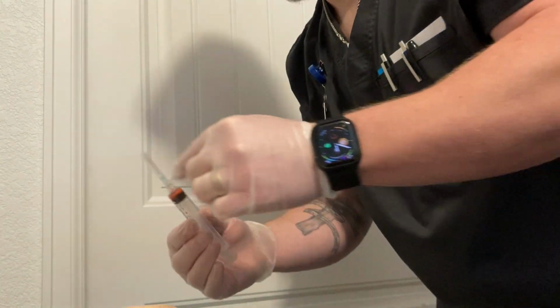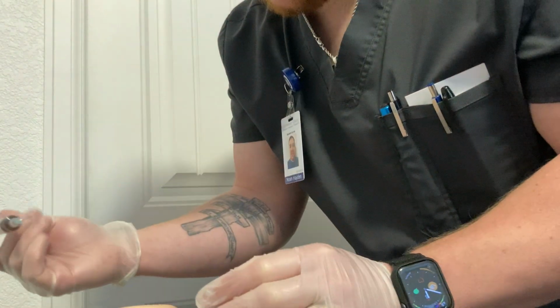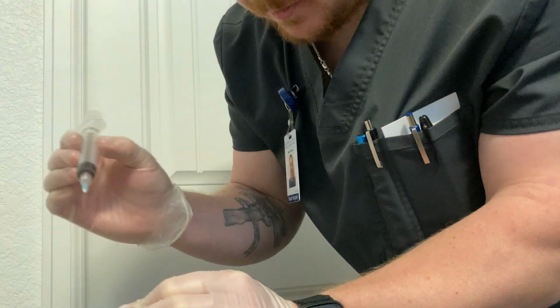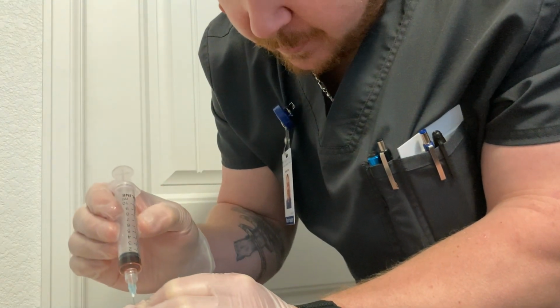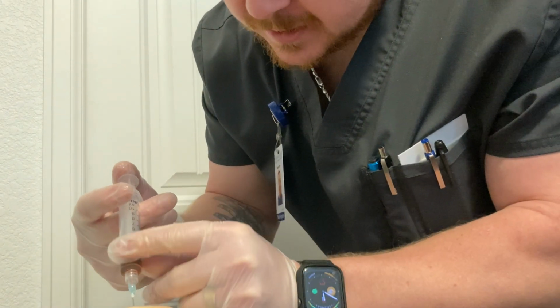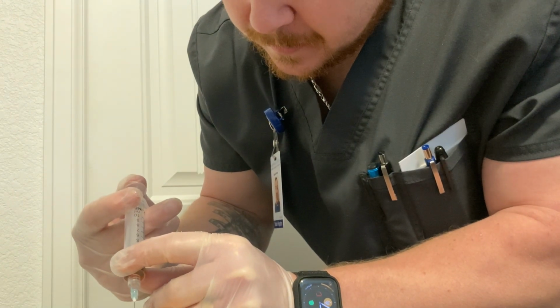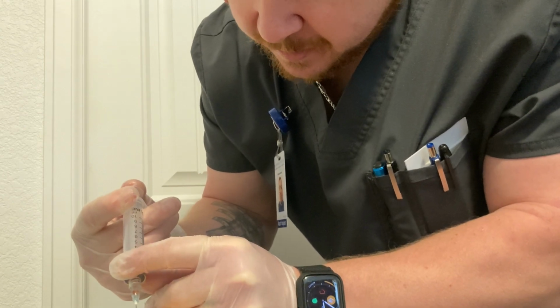For the subcutaneous injection, I'll remove my protective cover. Making sure not to touch my injection site, I will pinch, and I will insert quickly the syringe at a 45-degree angle to 90-degree angle. I will release, I will stabilize, and I will inject the solution slowly into my patient.